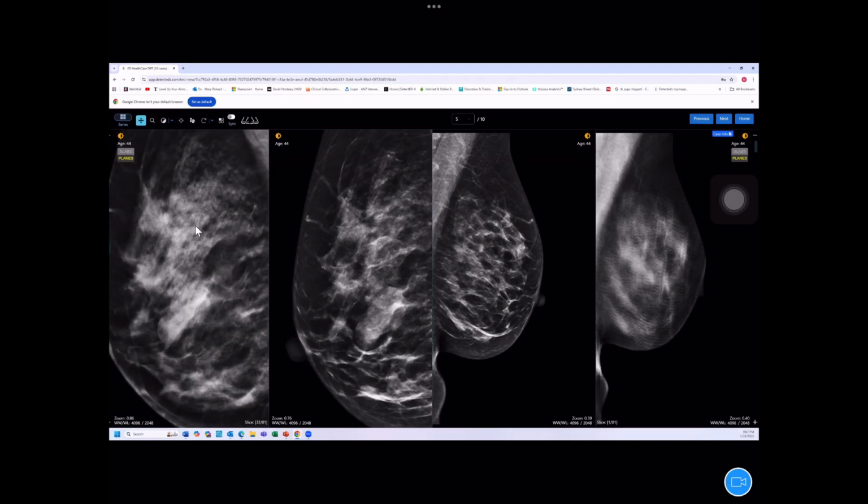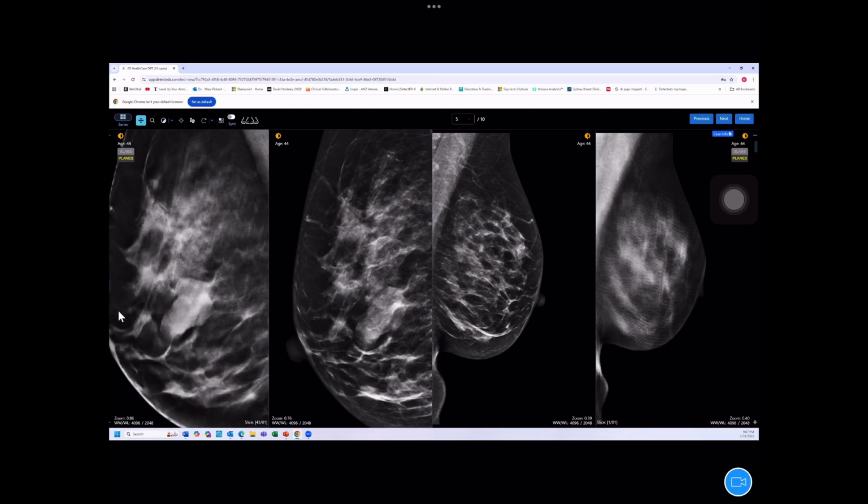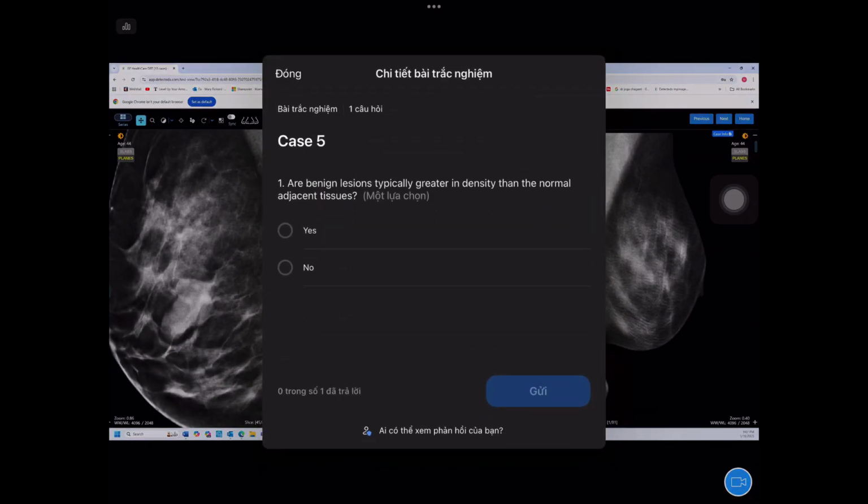And we'll have a look at the slice as we move through it. So what you can see on the other view as well is that it's got very sharply demarcated margins. They are lobulated, but they're extremely sharply marginated. And it's got a spongy shape with a bit of a nodule, a lobulation poking up the top, which you can't really appreciate on the original 2D image.